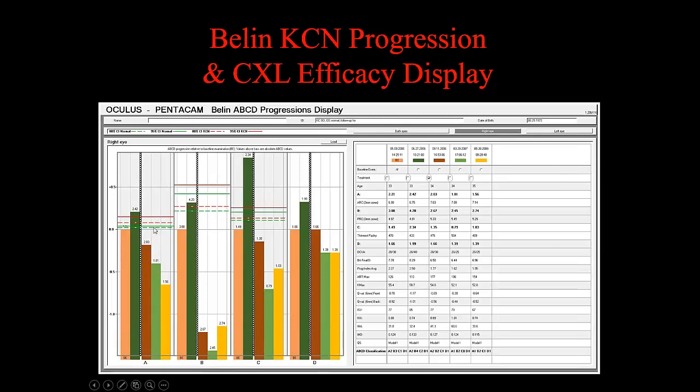These 4 color lines represent the different confidence intervals. The green hatch is an 80% confidence interval in a normal population. The solid green represents a 95% confidence interval in a normal population. The red hatch is an 80% confidence interval in a keratoconic, and the solid red is a 95.